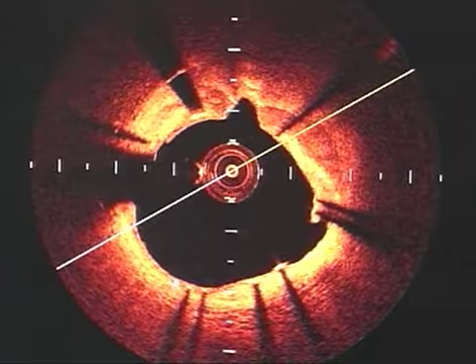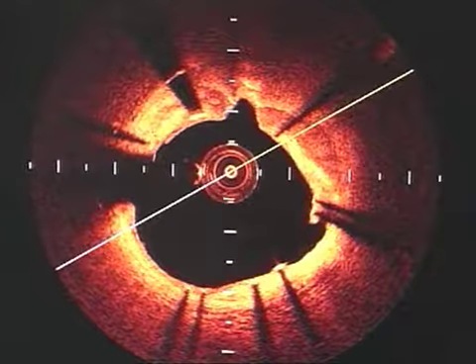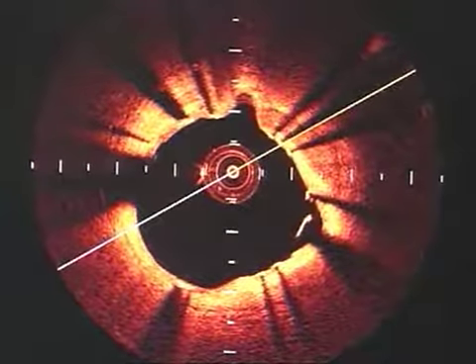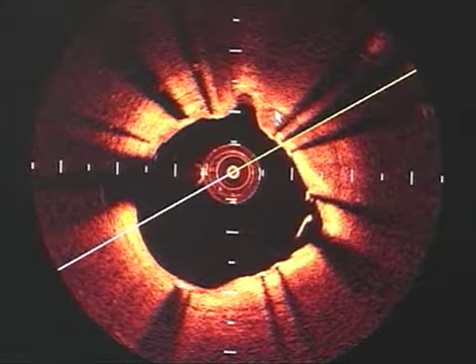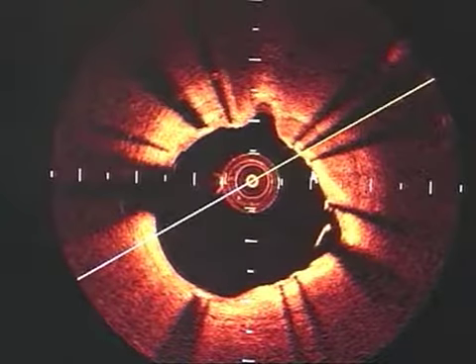Very fine. But the key is, yeah, good, beautiful. Let's go more proximal. Please, can I just suggest your stent strut on the top? Yeah, here. Can we magnify that stent strut? We just don't know. That's the area where we need to see, right?